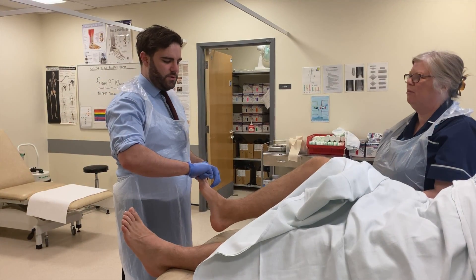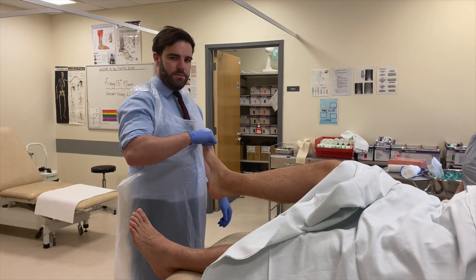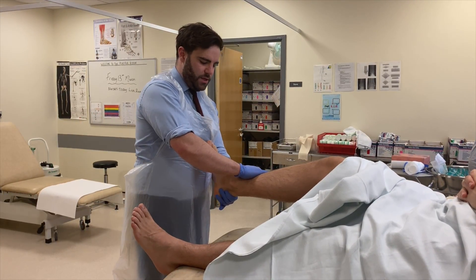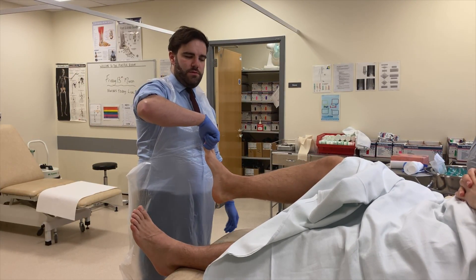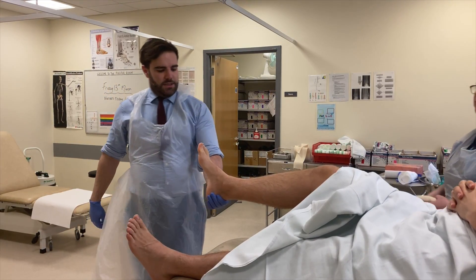I'm going to manipulate George's ankle here. Normally, just picking up the big toe reduces it. Sometimes if it's out the back, you may need to grab the heel and just push the tibia down while bringing the heel back up. But generally, just when they're relaxed — and obviously George would be sedated by A&E — just holding the big toe, and then that allows Sally to do her business.